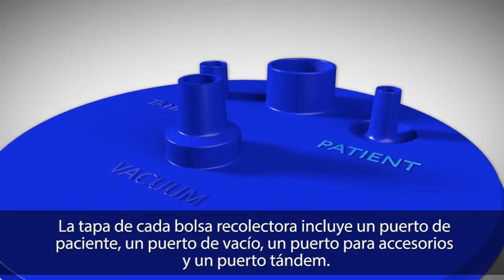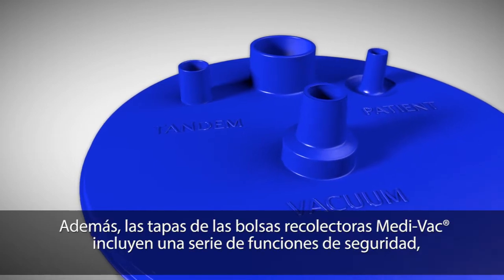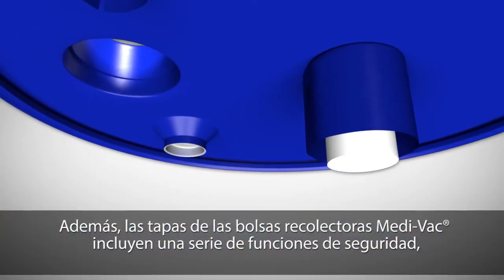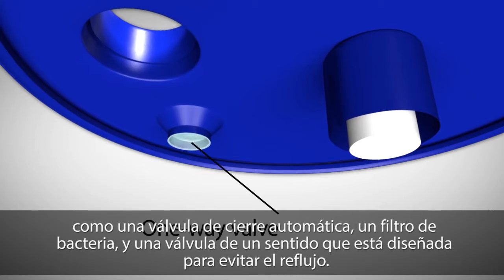Each flexible liner lid includes a patient port, vacuum port, accessory port, and tandem port. In addition, Medivac flexible liner lids contain built-in safety features such as an automatic shutoff valve, bacterial filter, and one-way valve designed to prevent backflow.